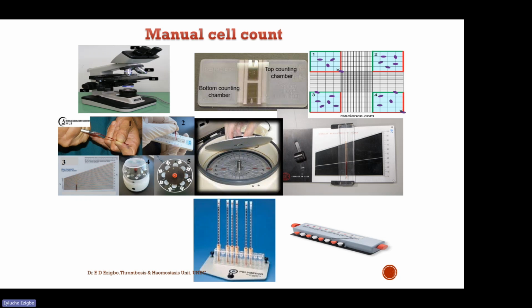We also do our platelets, we do the ESR, and we count with this counting machine, and then check the results with the microscope, which is very, very time consuming. Before you can finish a patient sample, you may be spending up to hours.